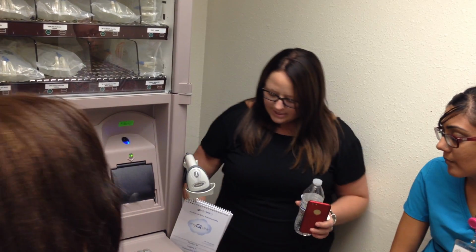There's a ton of stuff in here though. Okay. So in the tackle boxes, they can only do like 48 oral solids. I believe it's really limited in the state of California. There's no limit with this. So you guys have lots of warfarin, nystatin, penicillin cream. Wait, that's exciting. I know, I think of all the fun things we put in here that nurses get excited about. All of your IV supplies are in here.